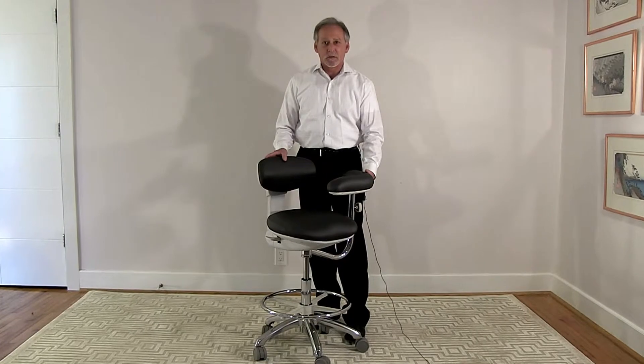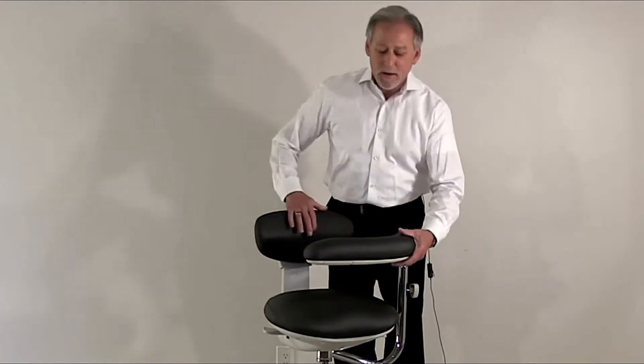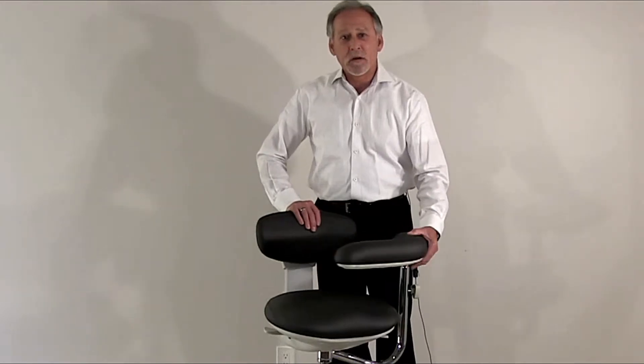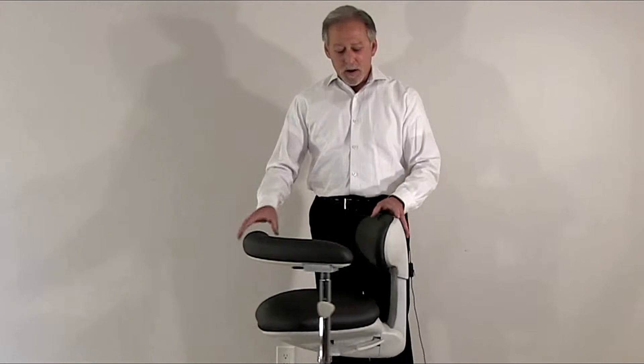Because it is an assistant stool, it has a ratcheting arm that is both height adjustable as well as adjustable in or out. This ratchet also locks in every position so it won't tighten up on the user throughout the operating procedure.